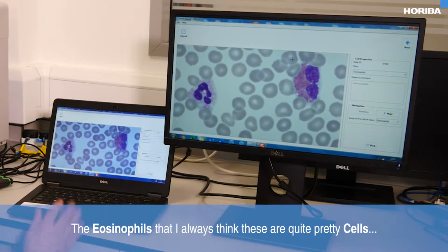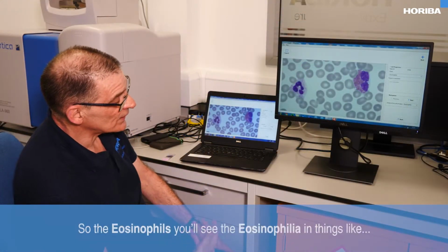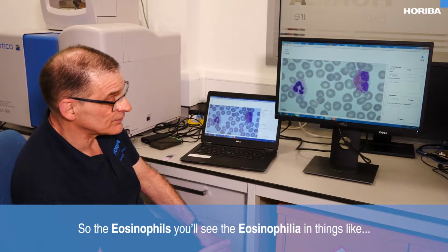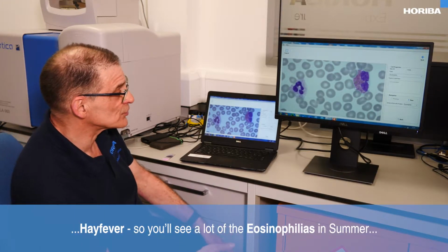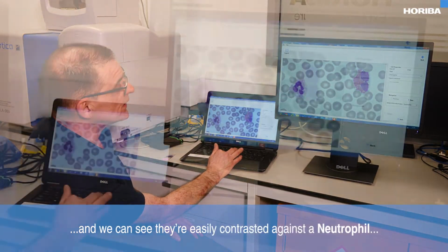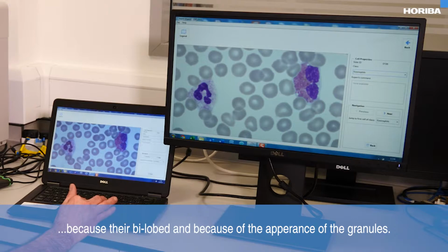Eosinophils, I think these are quite pretty cells. Bilobed nucleus, very bright granules. So eosinophils, you'll see in eosinophilia in things like hay fever, so you see a lot of eosinophilias in summer, and we can see they're easily contrasted against a neutrophil because they're bilobed and because of the appearance of the granules.